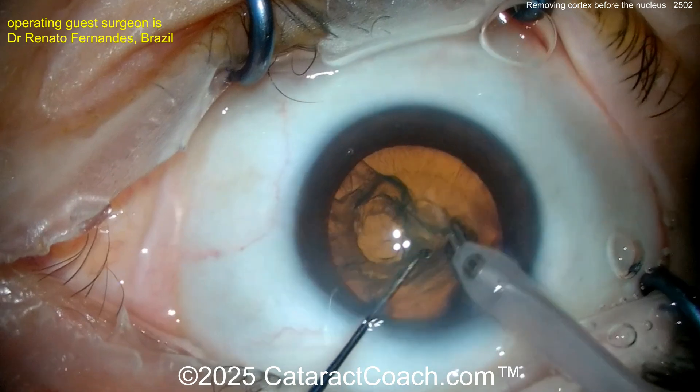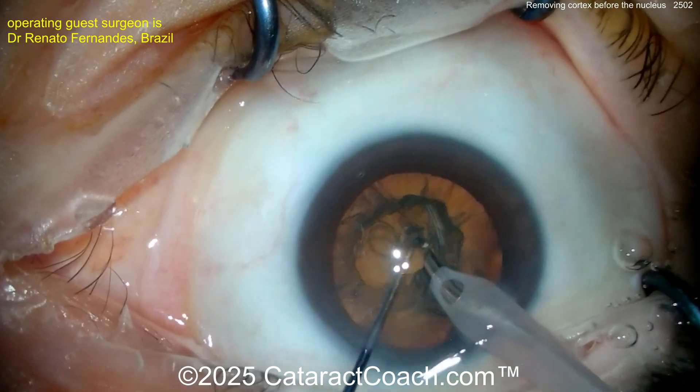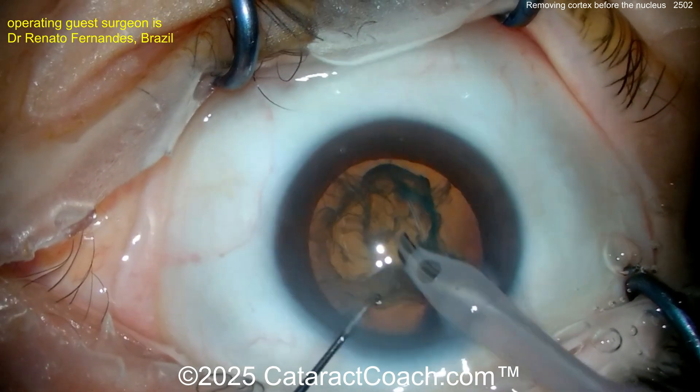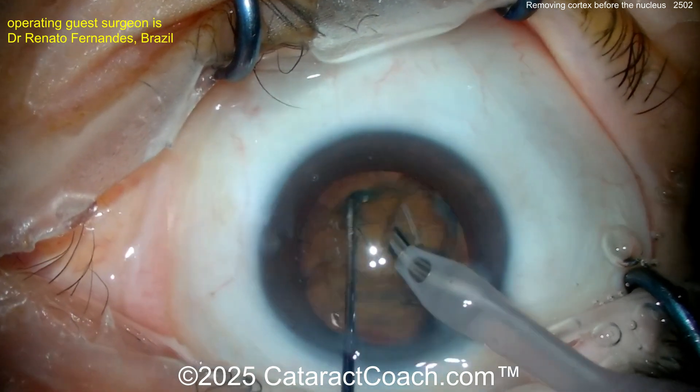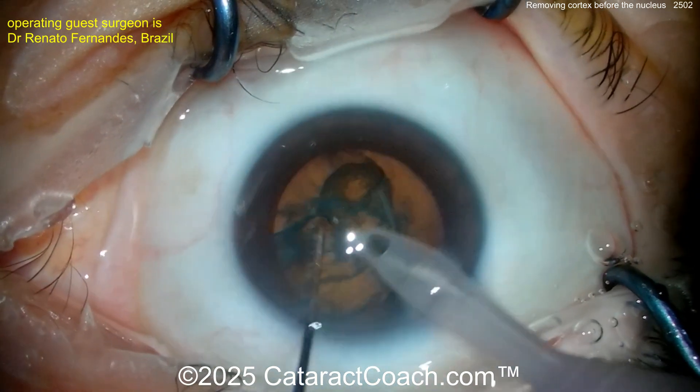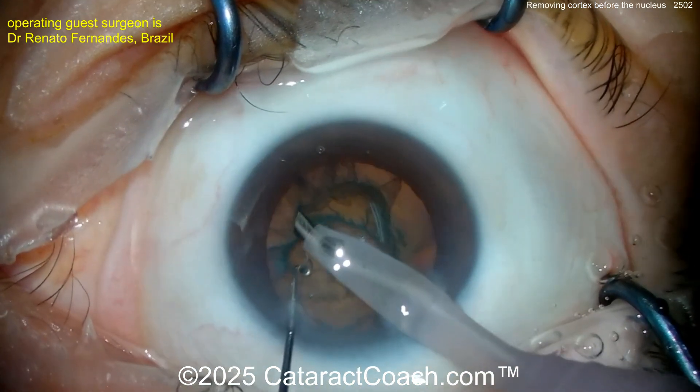Removing cortex with the phaco probe right up against the rhexis — obviously don't damage the rhexis here. Even go underneath the rhexis a little bit. Rotate this around, there we go, and then aspirate, aspirate, aspirate.